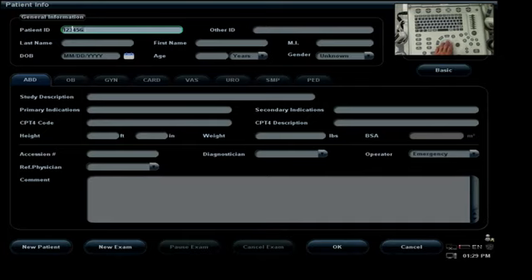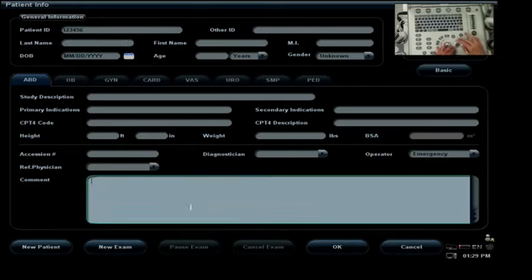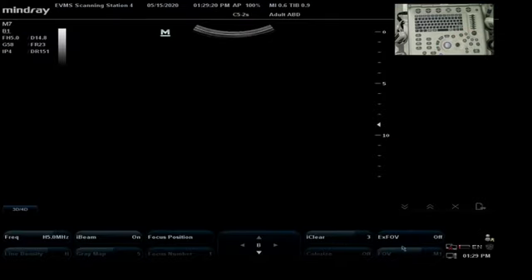Okay. Okay. Do I have to start over, or am I going to just from where? Okay. And then we go to the machine. Okay. Some of those, and use your PowerPoint to guide Okay. you. Okay. I hadn't been going there yet. That was why I didn't. Yeah, I'm just trying to get them to see the buttons more, right? Okay. Your slide All right. tells them what they're going to do, but it doesn't show them what they're going to do. It doesn't. And I was going to do it when it said, let's go to the machine and do this. But I'll But just it's do it. too many slides away. Okay.